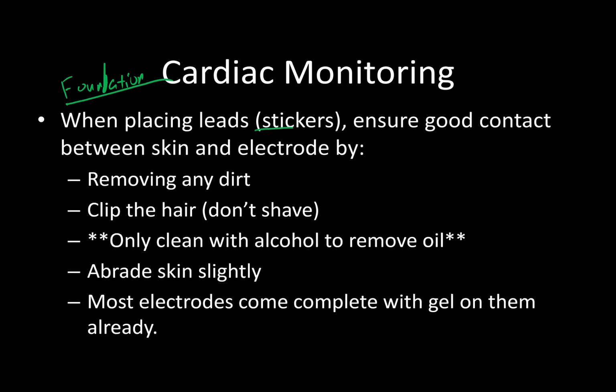So the absolute most important things you need to do whenever you're placing them from the very start is, of course, removing any dirt. It's kind of a given. Clip the hair. Don't shave them, but get the clippers out. Get that chest hair out of the way. It's just going to make a big difference. Don't clean with alcohol pads unless they have really oily skin. You don't want to mess with that because then the skin gets dry and it doesn't work well.